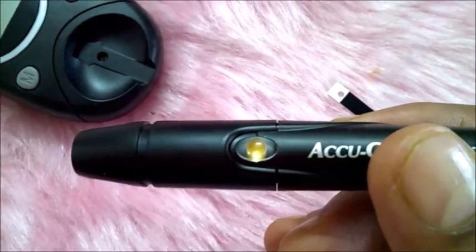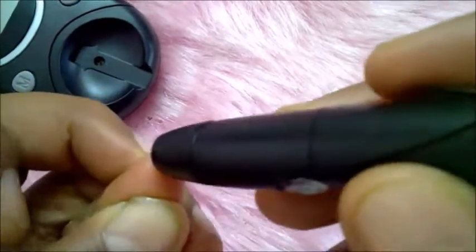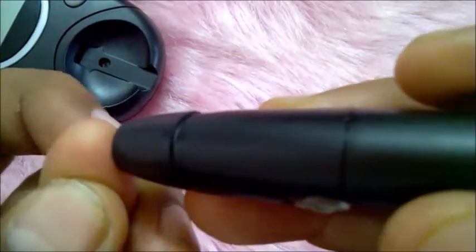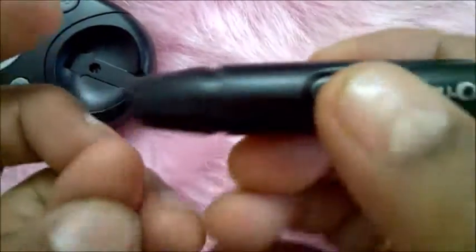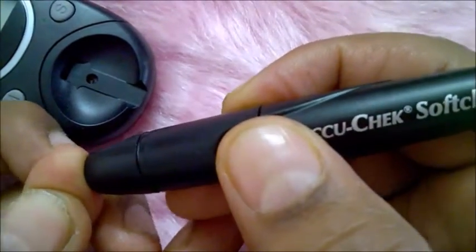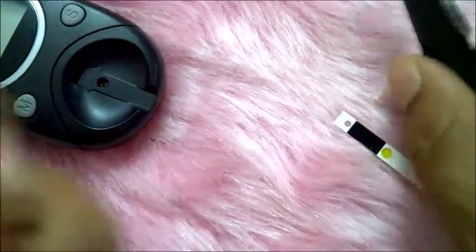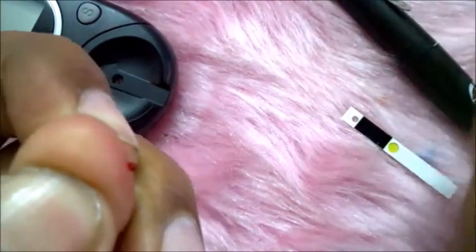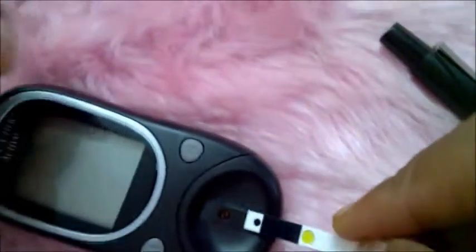The only thing I have to do is press on this yellow button to prick the finger. I keep it here and just press the yellow button — small sensation — and the blood comes out. Now keep it as it is.